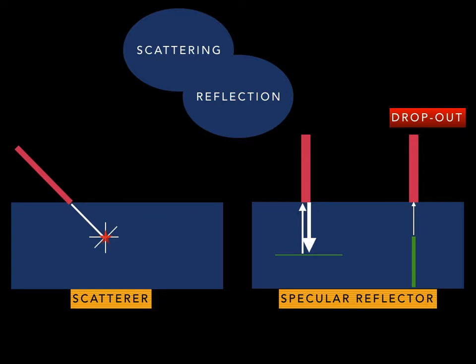On the left-hand side of the image, there are small irregular surfaces that will reflect the ultrasound beam in multiple directions. These are called scatterers. These reflections are very weak when compared with the specular reflections. An example of scattering is myocardium.